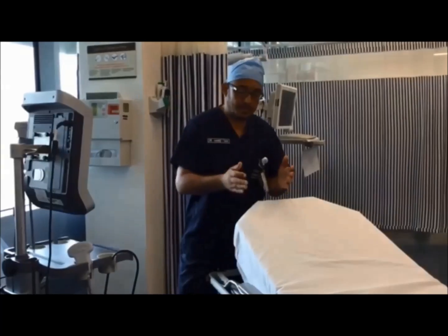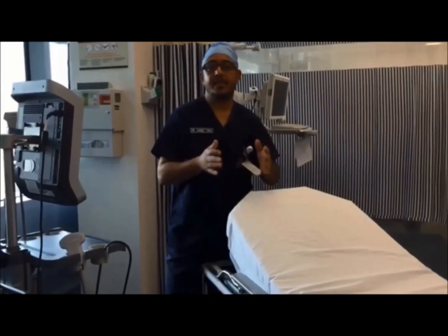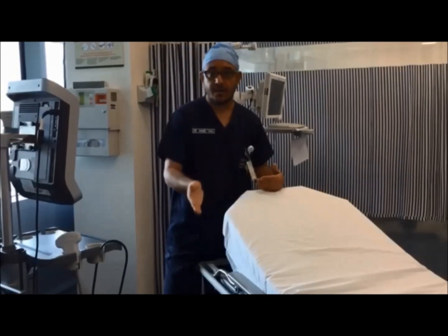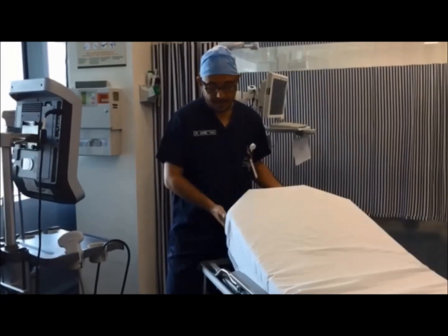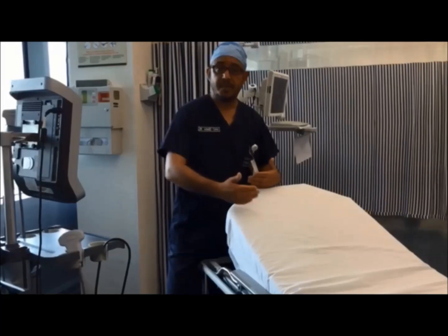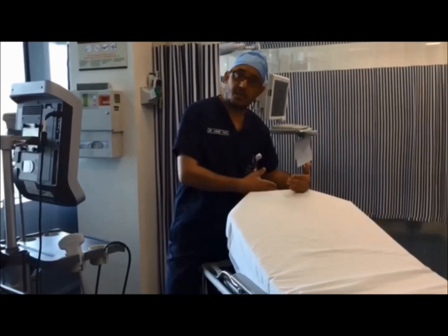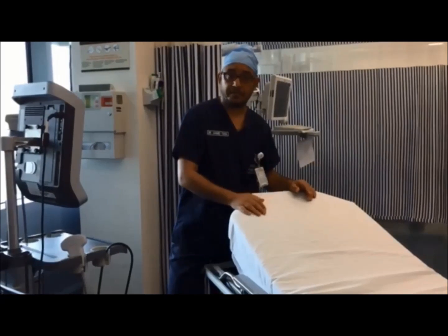The out-of-plane technique is very simple and can be achieved in 30 seconds. First, if I'm going to block the right side, I stand at this position close to the head of the patient on the right side. I lift the head up to make the patient close to me, with the patient's head just at the edge, as close to me as possible.